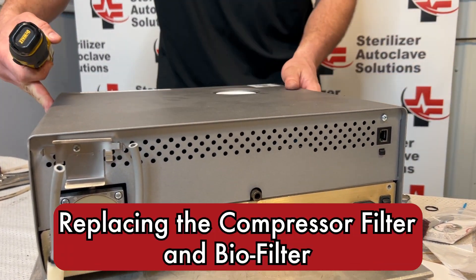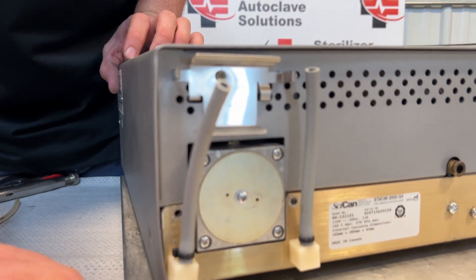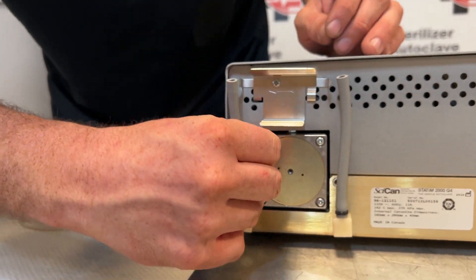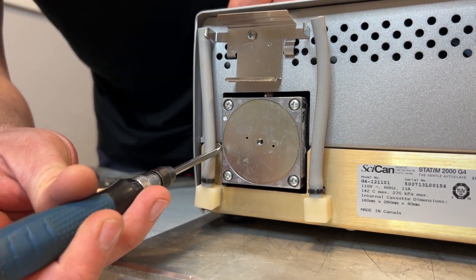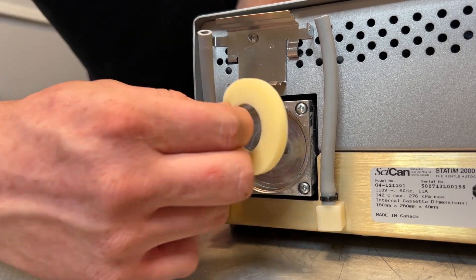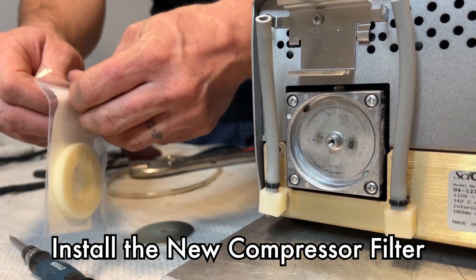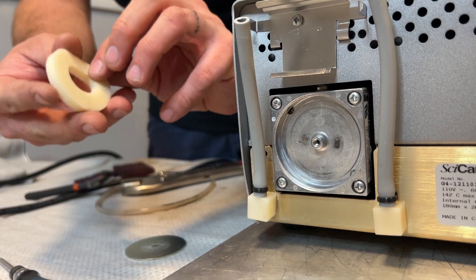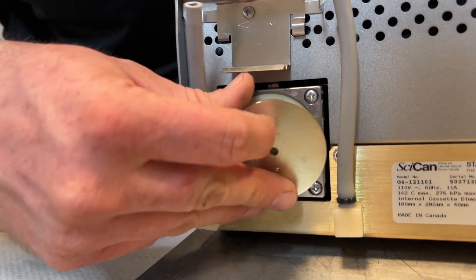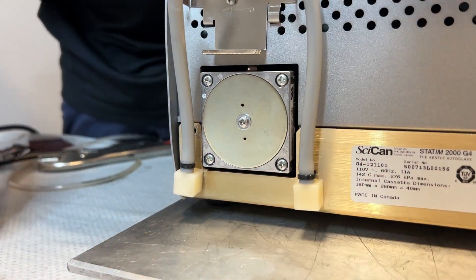The next thing we are going to replace is the compressor filter, located right here. There is a single Phillips head screw that holds that plate on. Remove that screw and the plate should pop out — if you have any issues, use a small flathead to pop it out. Set that off to the side, grab the new Sican compressor filter, press it into place, push the plate back over, and screw it into place.